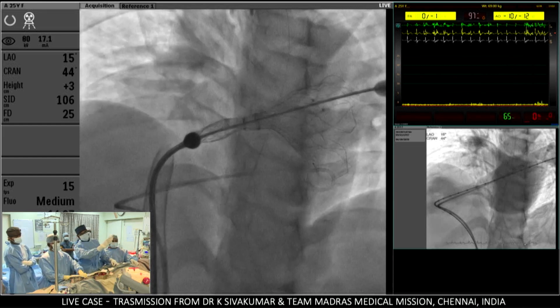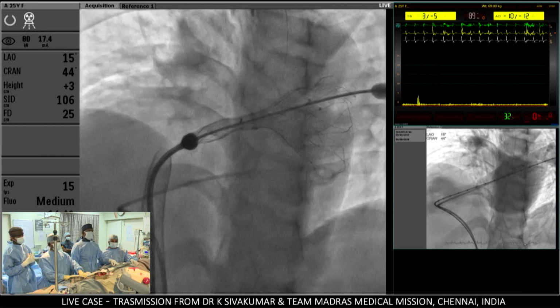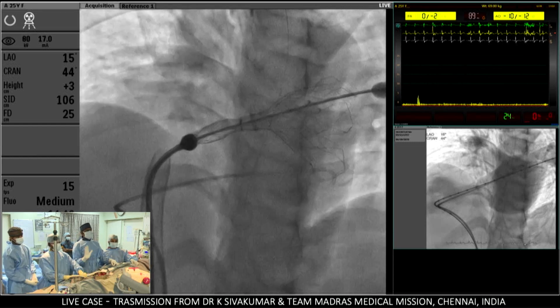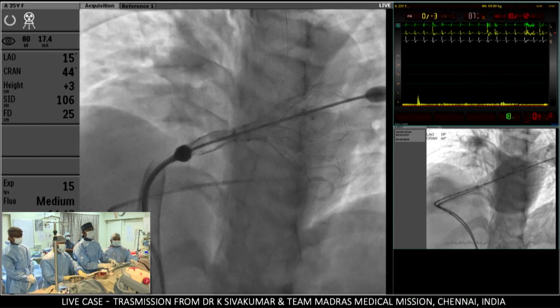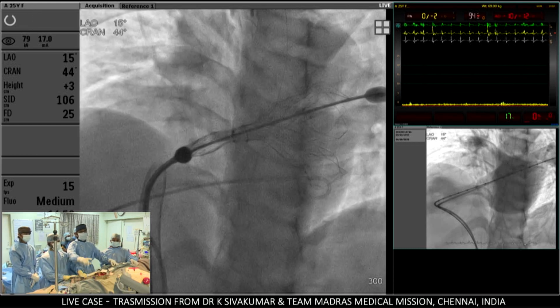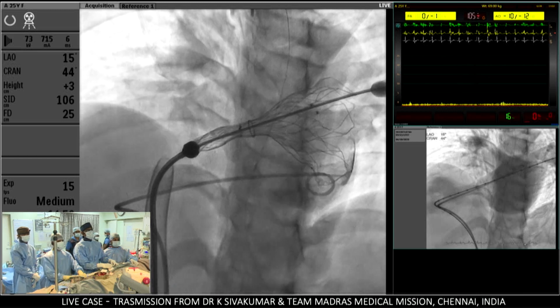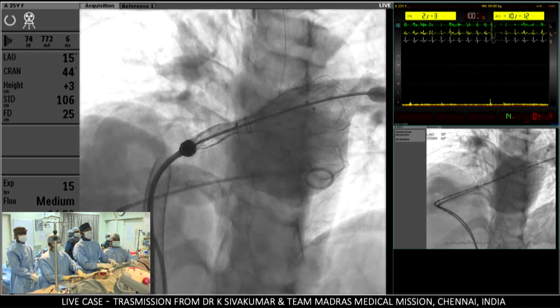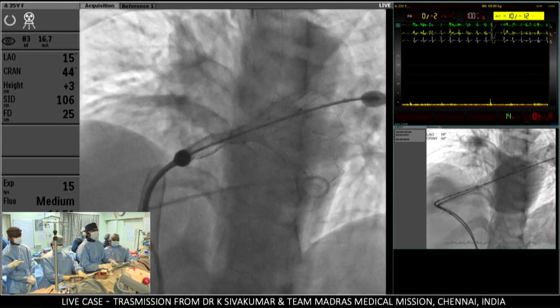Pramod, you come up. Be very slow now. Varakan, Shiva, if I were you now, I probably may not open more. Yeah, but we'll pull back until we are close to the waist. Okay. Yeah, now you have to go back significantly.